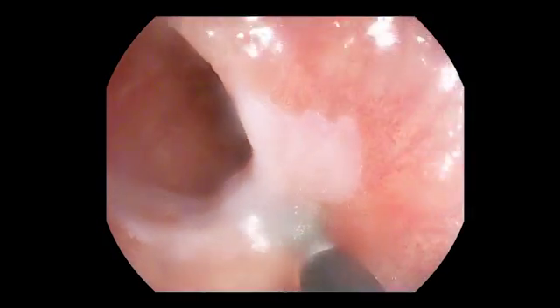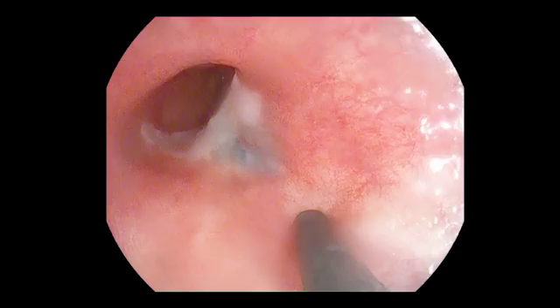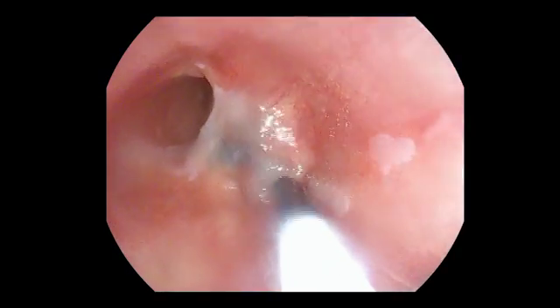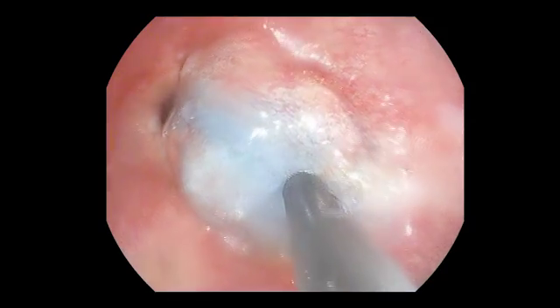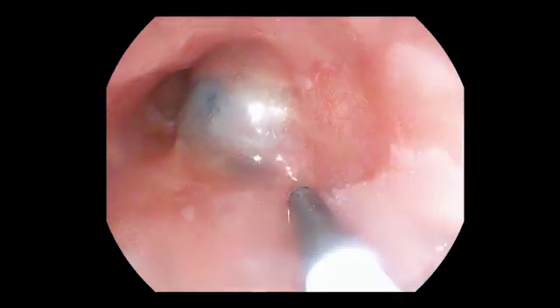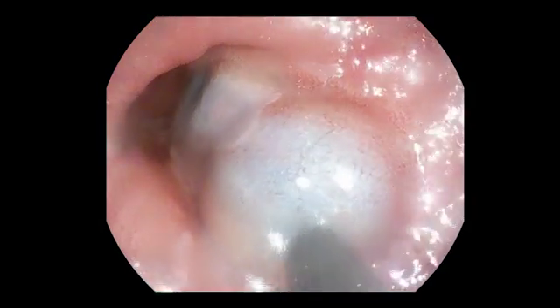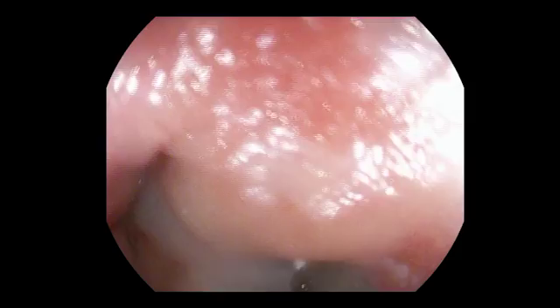Stop. Needle out. Inject. Stop. Needle out. Inject. Stop. Needle out. Inject. Nice, stop.